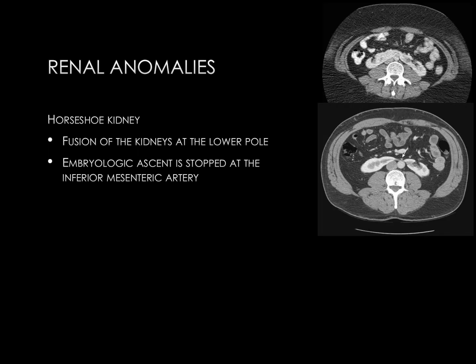At the right side of the slide, we see two axial images from two separate patients with horseshoe kidney. The connection in the midline may be comprised of renal parenchyma, as in the upper patient, or of a fibrous band, as in the lower patient. The lower patient also demonstrates the inferior mesenteric artery, indicated by the white arrow, which has stopped the ascent of the kidneys — positioned in the mid-abdomen rather than the upper abdomen.